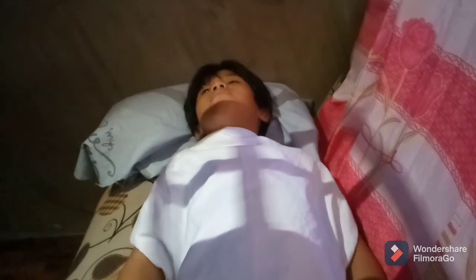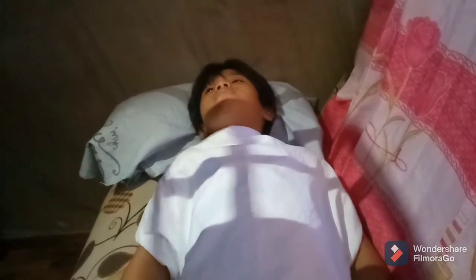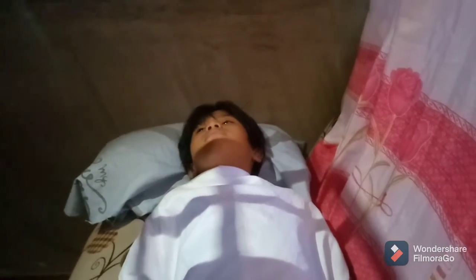In respiration, make sure that you instruct the patient correctly, and expose the patient at the end of the second full inspiration.